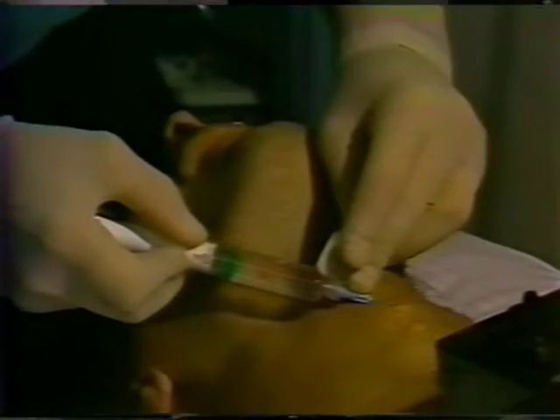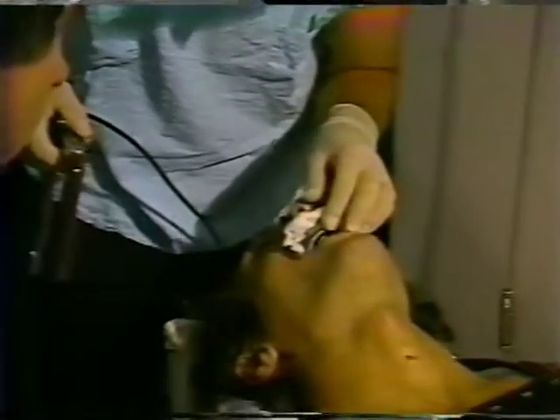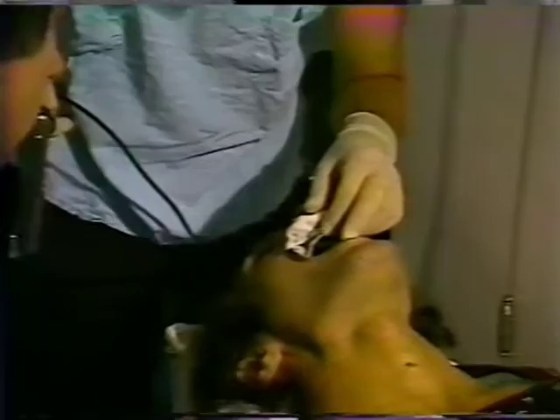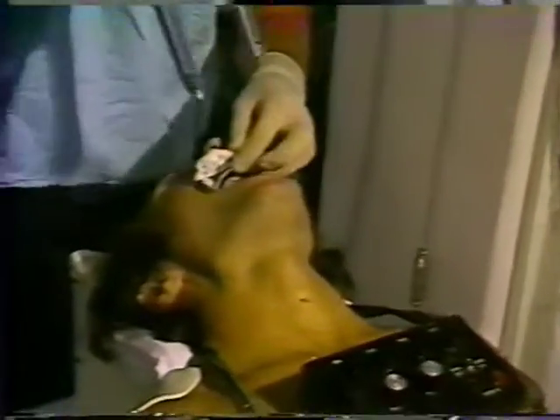This next section is the most critical one, since no matter how carefully we screen the subjects, occasionally it is impossible for the subject to tolerate the insertion of the laryngoscope so that the full vocal fold length can be observed directly. First, a lead tooth guard is inserted to protect the subject's maxillary teeth, and the laryngoscope is then inserted to the pharynx, then into the larynx.